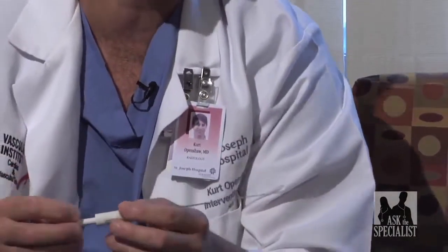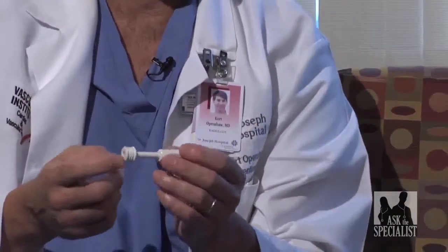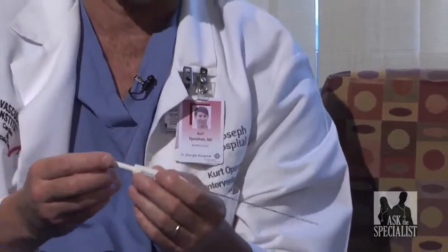And it works with an alternating current. Basically, a power source connects back to the back of the needle. It creates an alternating current, which makes the molecules in the tissue vibrate or oscillate back and forth extremely fast, and that creates frictional heat. If we heat tissue above 50 or 60 degrees Celsius, it kills it. It doesn't matter whether it's tumor or normal.